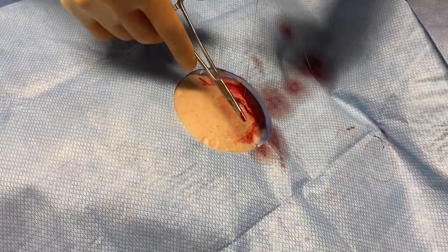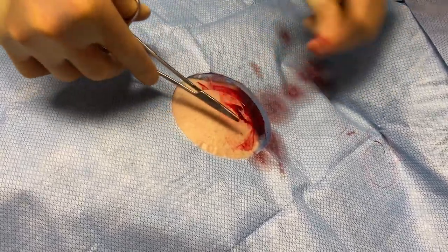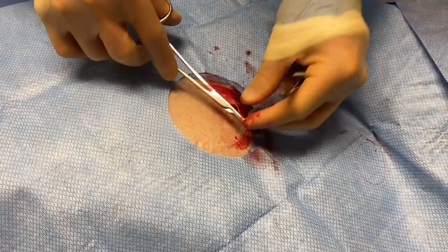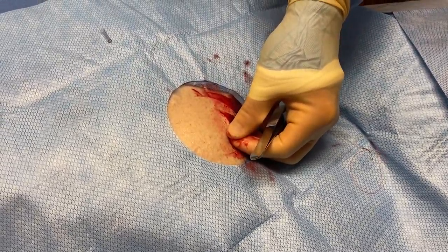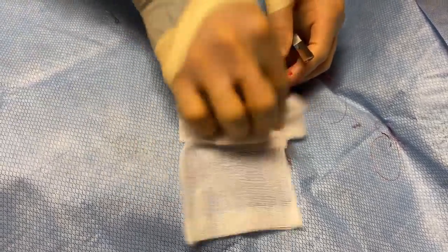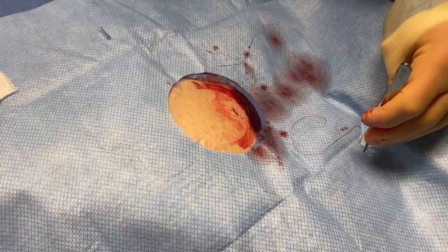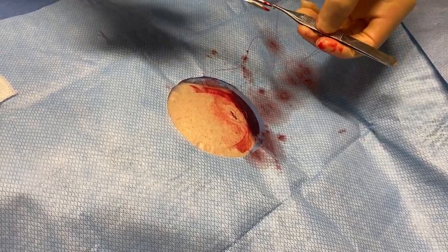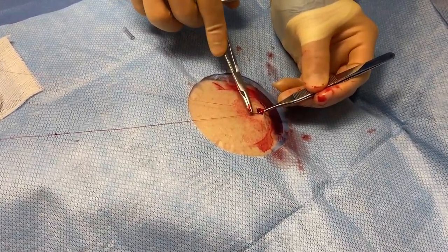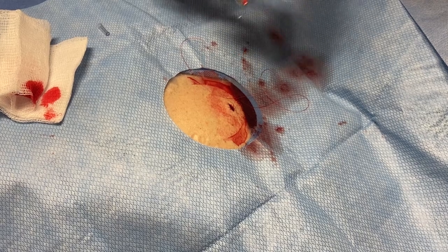The skin has lots of capillaries, so it likes to bleed. I can actually use the insertion tool as a suture cutter.